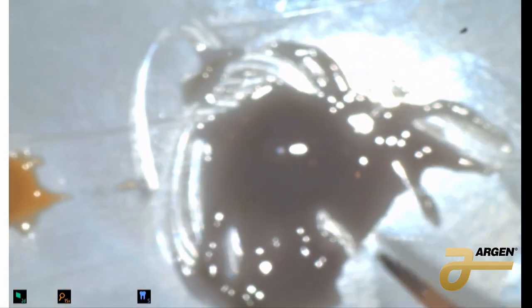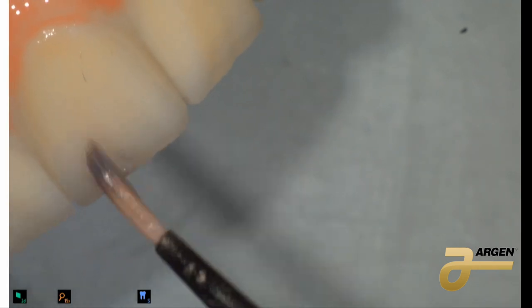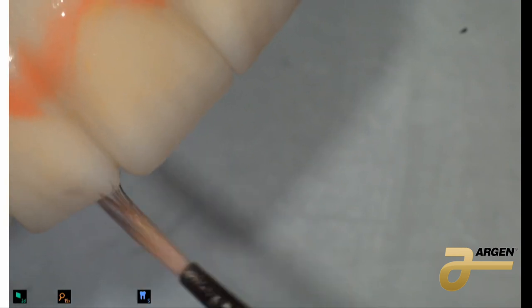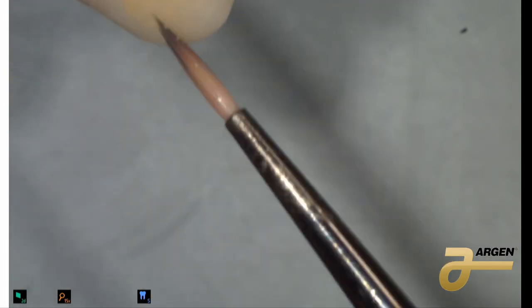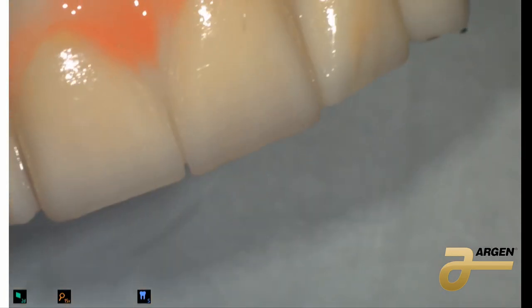Now we're going to paint the cervical area with the mixer I already made — that is gray and purple. I'm going to go with the incisor area with this to break the value and bring the value down in the tooth. Remember, zirconia is white and the value is a little high, especially in the incisor area. Make sure you put it on both sides — distal and mesial — because remember, the patient is going to smile laterally too, and somebody can see it.